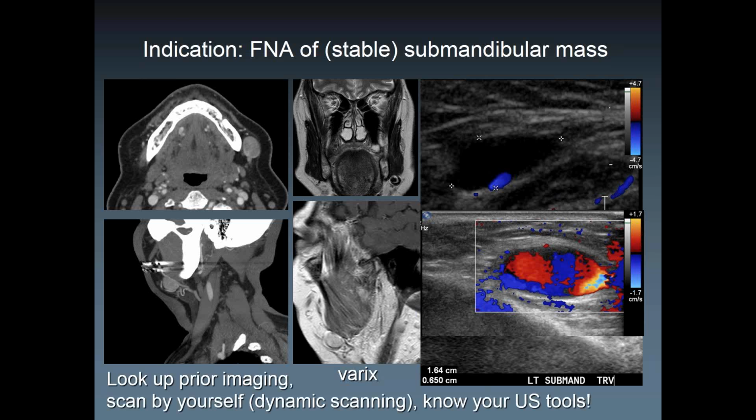All right, so just look at everything you have, look at all the sequences that you have available. Despite the reports, you may pick up things that may not have been picked up before. It's pretty rare, but it could happen. And ultimately, because you are the one who's going to stick a needle in there, or are part of the team, take a look at the images yourself or scan yourself and play with the settings. Don't rely on others if you have any doubt. Mostly, yes, you can rely, of course, it's a good team, but you are the one who's ultimately responsible, right?